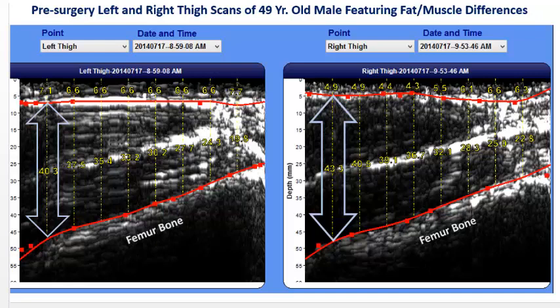The first red line feature in both scans is the strong ultrasound reflection from the interface between the fat layer and lean muscle tissue. We can see the fat thickness is significantly greater for the left thigh of the injured leg — 7.1 mm compared to 4.9 mm on the healthy right thigh.